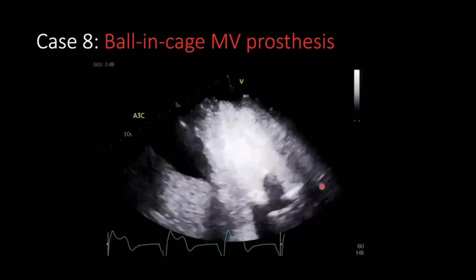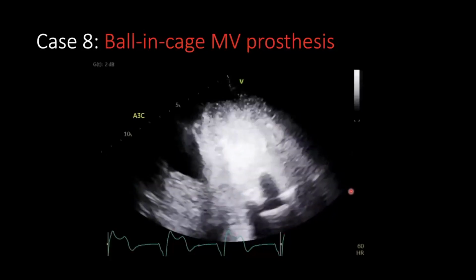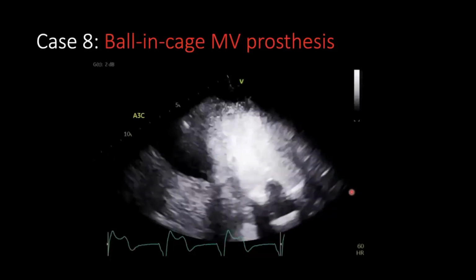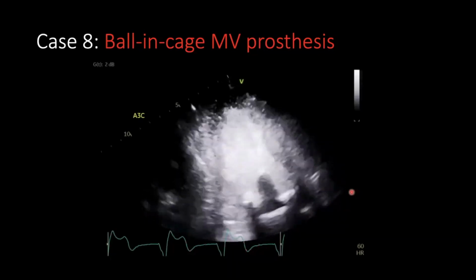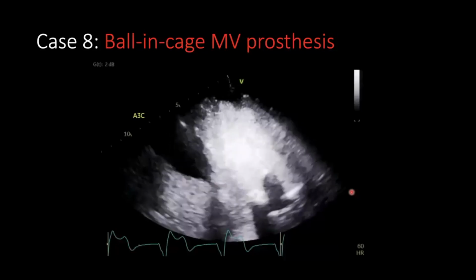And so this was from our lab for a patient who had it put in obviously several years ago, and it's doing well. So several. Yeah, more than several. It would have been at least 3 decades.